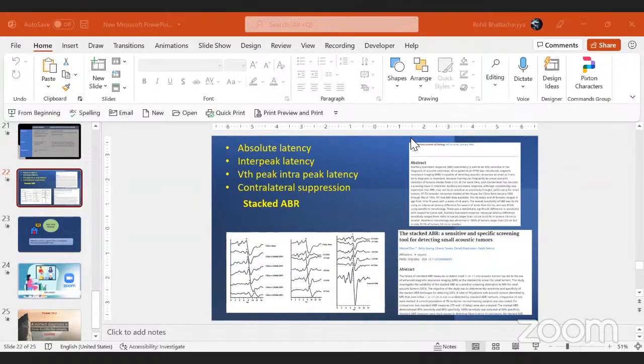Then also in case of auditory neuropathy, we may see a rising pattern at the initial stage and later a flat audiogram. And there are some syndromes, I don't remember right now, perhaps in case of syphilis, which mimic Meniere's disease, and one more syndrome was there, I don't remember. That is basically not a conductive pathology, but is affecting the cochlea or the hair cells. So in those cases, like Meniere's disease and ANSD, involving the cochlea and the auditory nerve, we may see a rising or ascending type of audiogram.